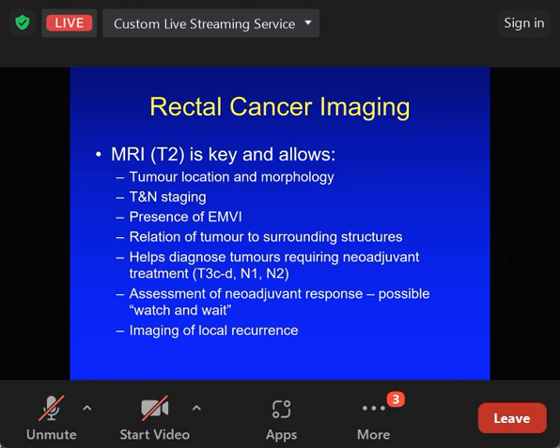Nadia, do you want to add anything? Yes, I wanted to add, because we do a lot of vascular imaging as part of the job. So yeah, I completely agree with Dr. Redding that normal appearance of bowel on acute abdomen doesn't exclude ischemic bowel. But if it's a borderline finding clinically, and if you suspect ischemic bowel, and if you want to re-image in 24 hours just to see the evolving changes, we may be able to help you with looking at the change in terms of edema, appearance of edema or free fluid, or which part of bowel is involved.